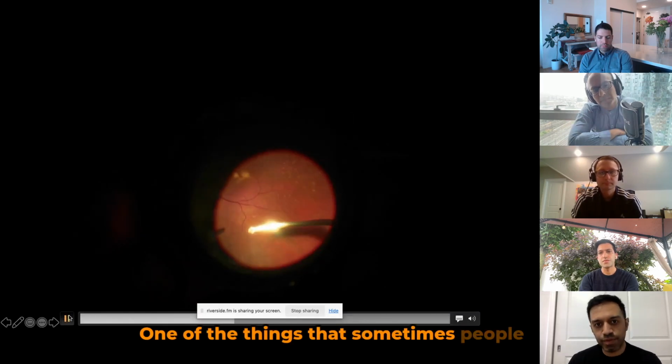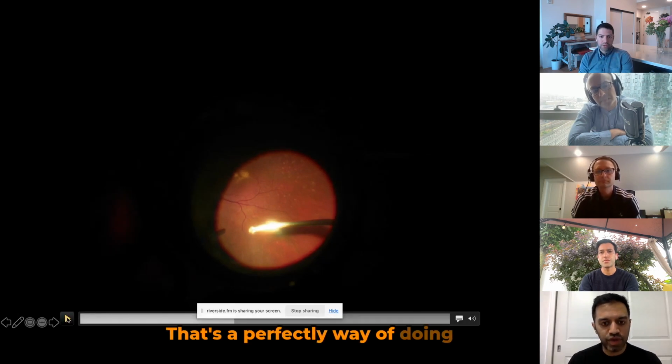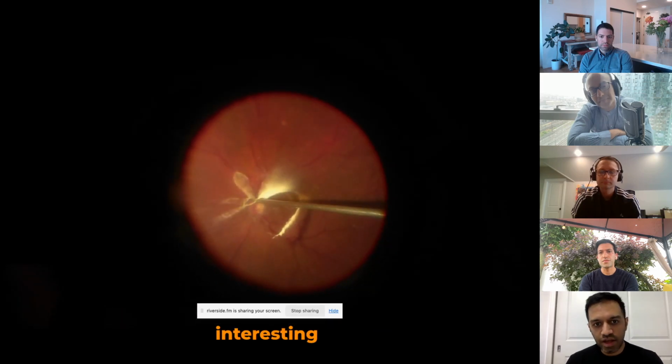One of the things that sometimes people can do is consider doing it under air. That's a perfectly fine way of doing it as well. I tend to say that you want to do that for pseudophakics. Now, here is an interesting process here.